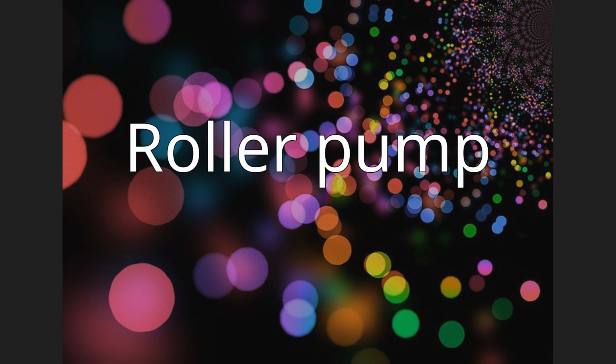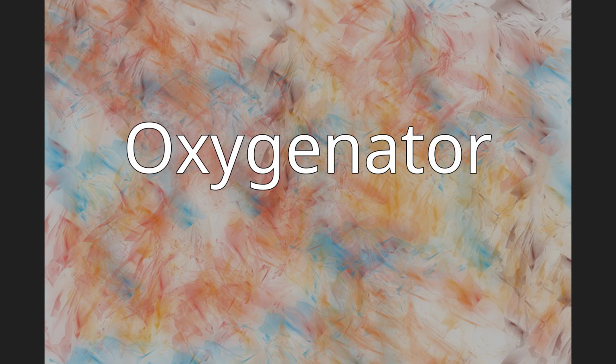They are also more likely to cause a massive air embolism. Oxygenator. The oxygenator is designed to add oxygen to infused blood and remove some of the carbon dioxide from the venous blood. Cardiac surgery was made possible by CPB using bubble oxygenators, but membrane oxygenators have supplanted bubble oxygenators since the 1980s. The main reasons for this are that membrane oxygenators tend to generate many fewer microbubbles, referred to as gaseous microemboli, which is generally considered harmful to the patient, and reduce damage to blood cells compared to bubble oxygenators.